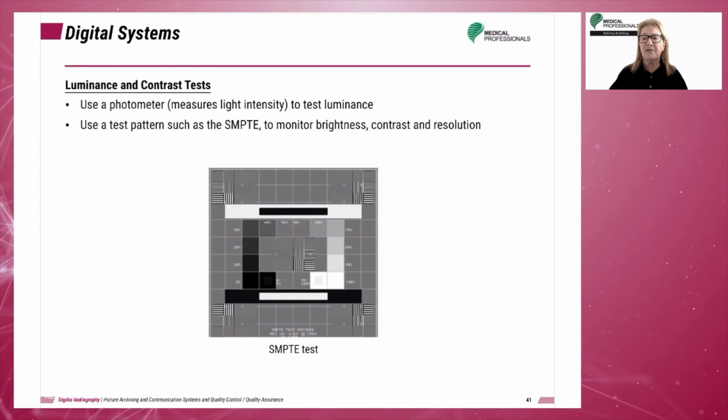Luminance response is the monitor's ability to accurately display different shades of brightness from a test pattern. These must be compared to adjacent shades of brightness. This function is essentially identical to a contrast test.